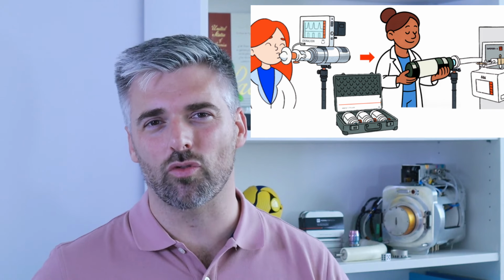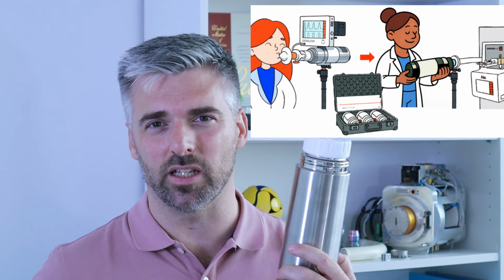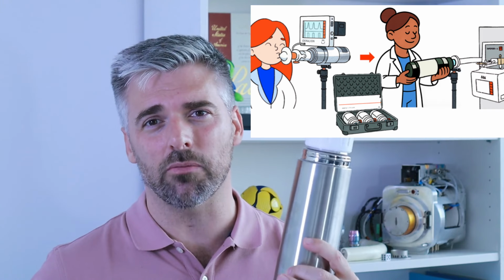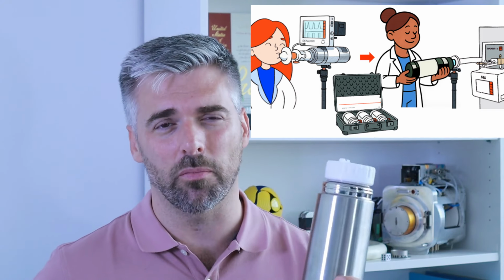Breath samples are stored and collected in bags like this, inside stainless steel canisters like this. The canister has heaters, sensors, and valves inside to control the temperature and how we inflate the bag when we exhale into it, and empty the content of the bag when we put it into the analyzer. And the data produced with this is compatible with the data produced by blowing directly into the analyzer.